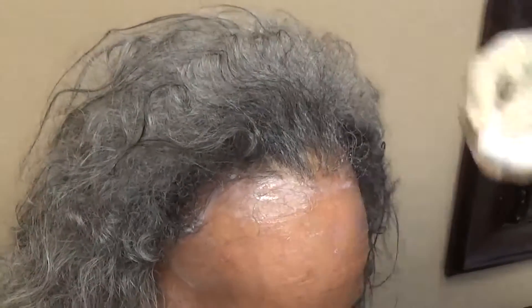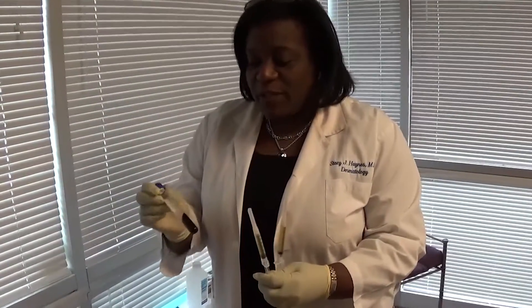Not only are we going to do the platelet-rich plasma, this time we're also going to do amnio. I'm excited — I can't wait to see how this works. This is the topical application. We'll do our regular thing where we inject with platelet-rich plasma, do the micro pin, and instead of doing hyaluronic acid, we're going to apply the amnion.